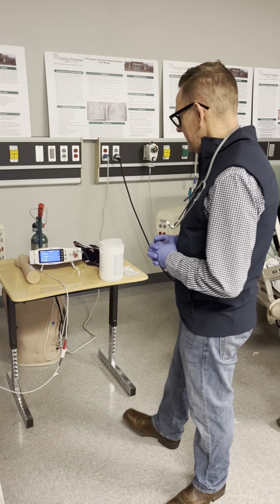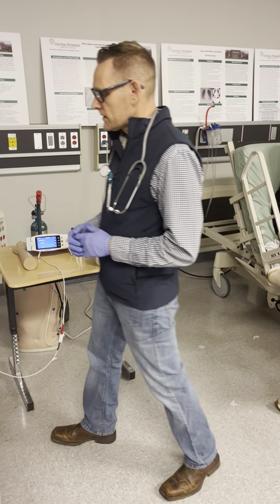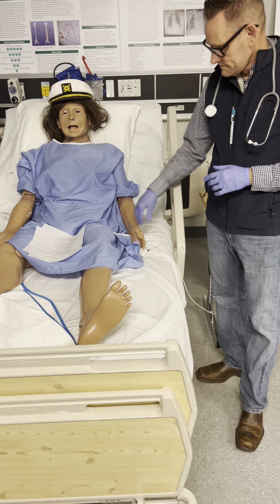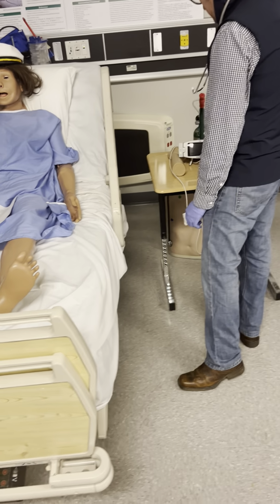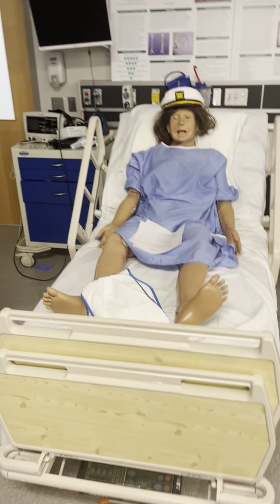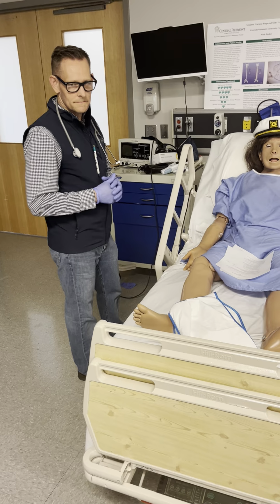We're going to monitor a PI, make sure we have adequate perfusion, and we're going to see SpO2 and a heart rate. This heart rate should match what you got just a few minutes ago. We get that, we're good. We'll put that away. We'll turn this off. We'll clean it, and we'll ask the patient if there's anything else that we can do for them. Are they safe and comfortable? And then if the answer is yes, we can deglove and phone out.